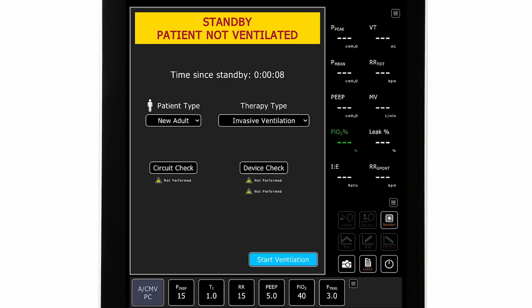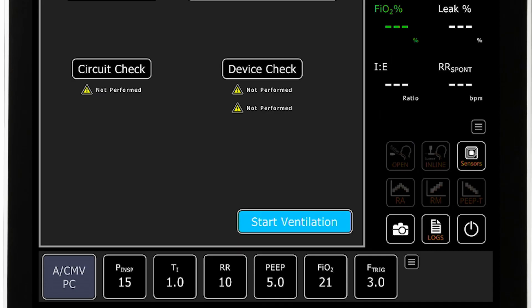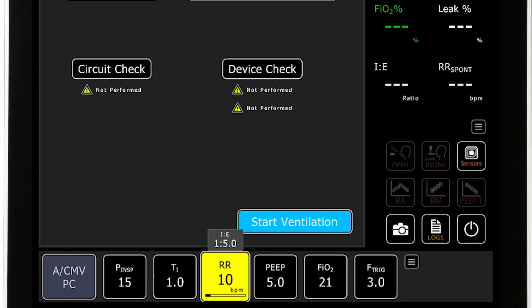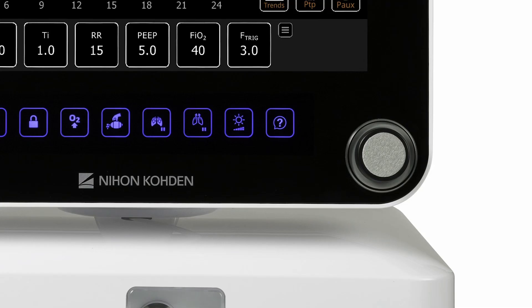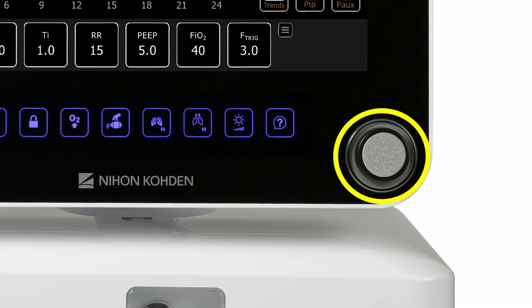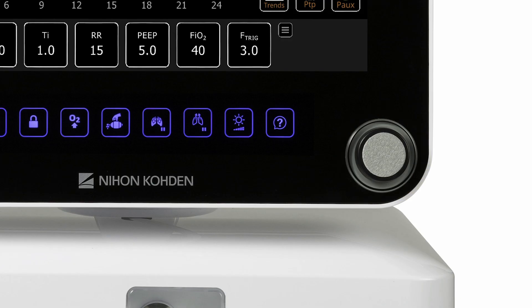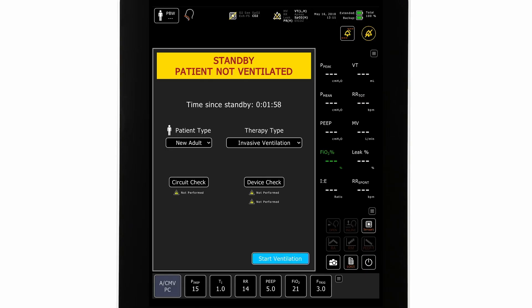Clinicians can also set ventilation controls and alarm limits prior to starting ventilation. To adjust a ventilator control, the clinician selects the control to be adjusted, uses the encoder to adjust the setting, then pushes the encoder in to confirm the setting. When ready to begin ventilation, clinicians press the start ventilation button.